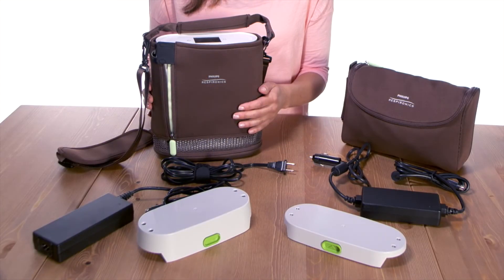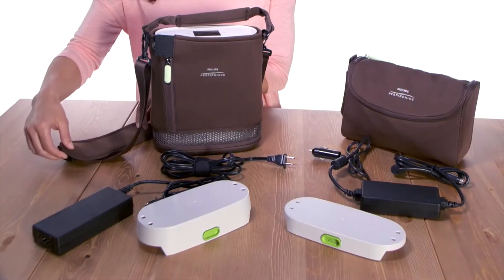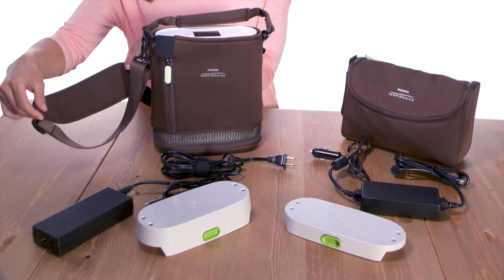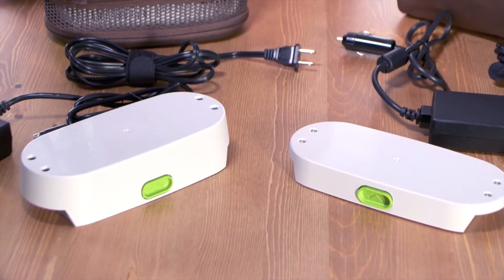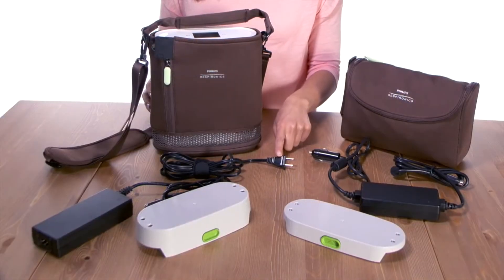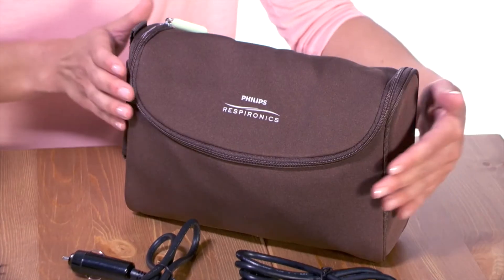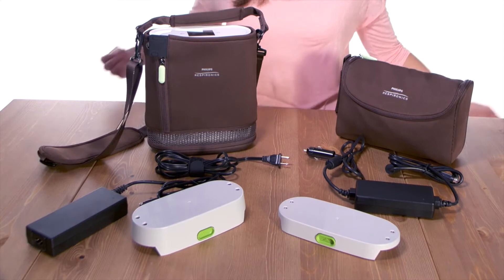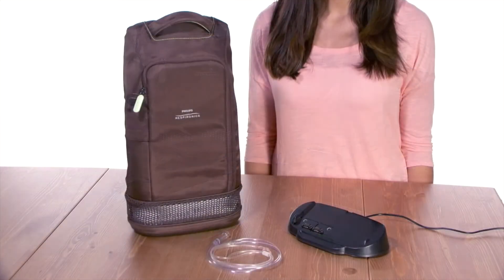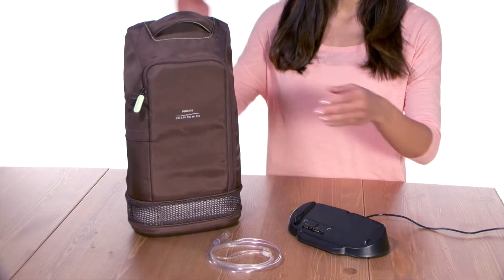The system includes several items: the Simply Go Mini device, a carrying case with a shoulder strap, standard or extended rechargeable batteries, an AC power supply and cord, a DC power supply, and an accessory bag. A user manual is also included. Additional accessories sold separately include a backpack and battery charger.